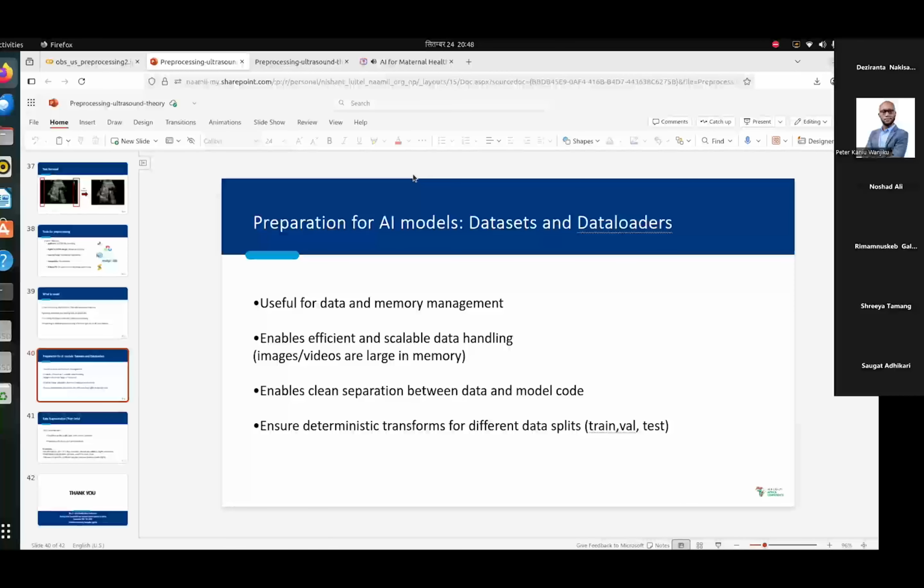In those cases you could convert the pixel spacing to a common spacing, so that the distance between two pixels always represents the same spacing in the physical space. If that's the case, then it is good to bring all of the data into the same physical dimension.